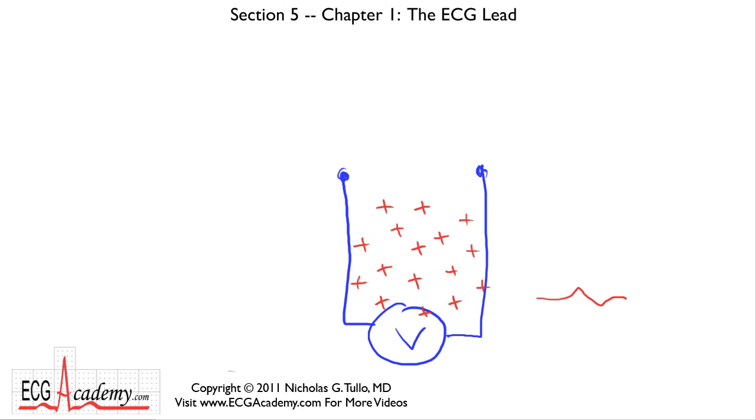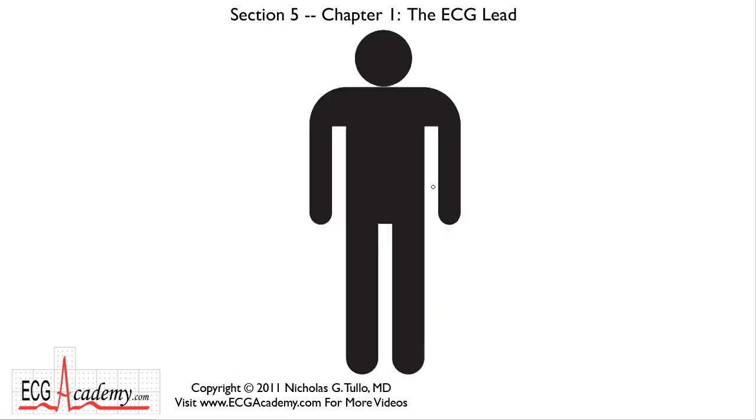All right, so what are we talking about in a person when we're looking at the electrocardiogram coming off of an ECG system? Well, remember we have different color codes. The black is the left arm, white is the right arm, green is the right leg, and red is the left leg. Well, in the early days of electrocardiography, they used a bipolar recording system to look at the electrical signal that's traveling between the right arm and the left arm.